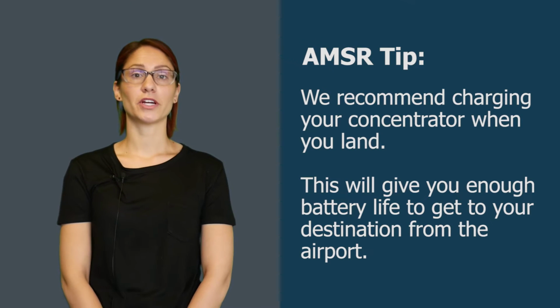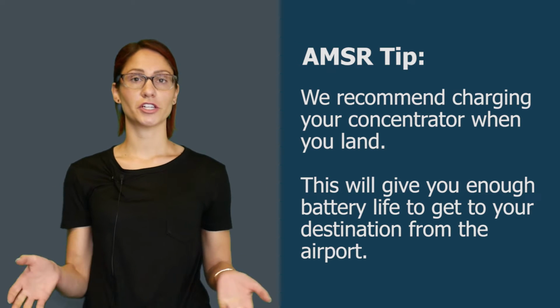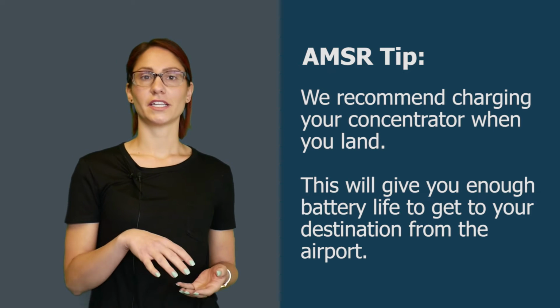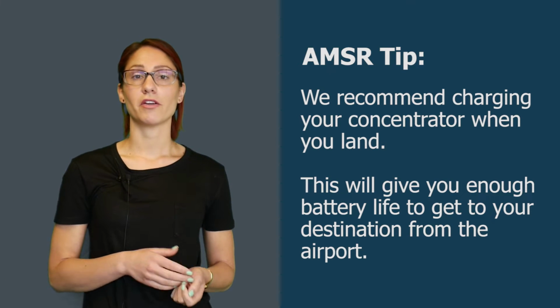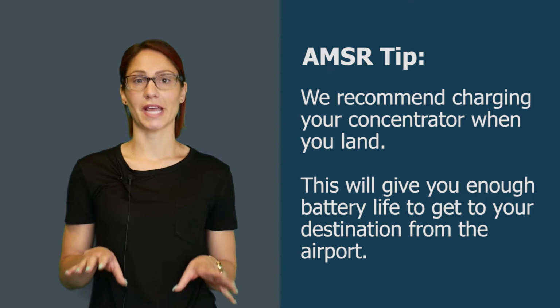And the last thing to remember is once you land, make sure that you are taking the time to recharge your batteries if you have the time to do so. So in between flights, if you've got a layover or if you land and you're in the airport waiting for your luggage, plug that machine in, get those batteries recharged so that way you have more than enough battery time to cover you for your entire travel day.